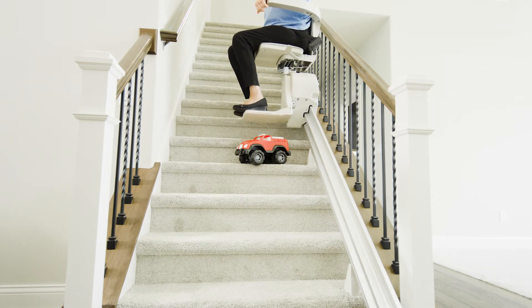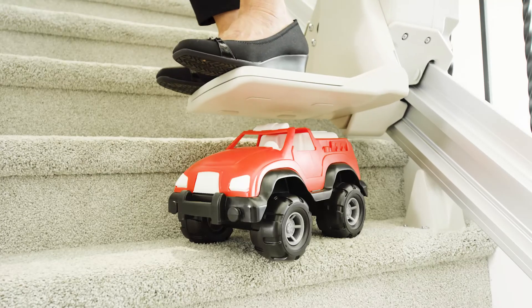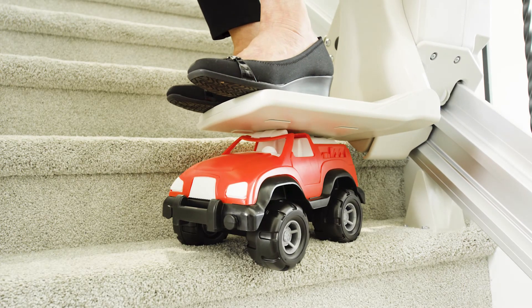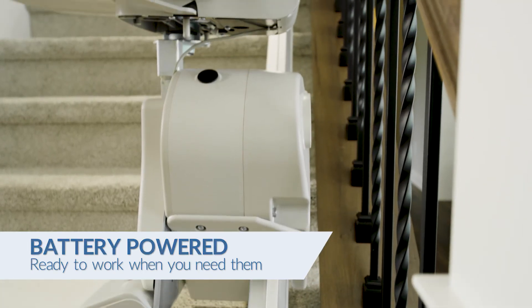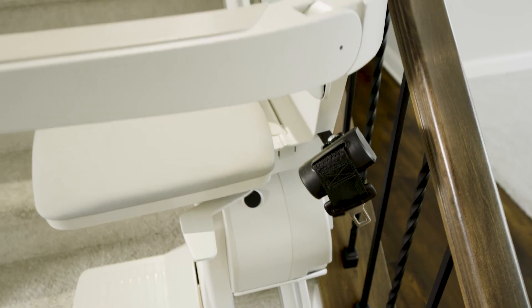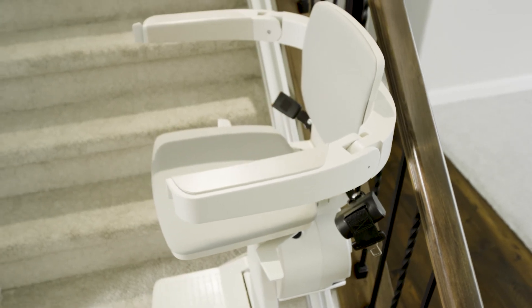Safety sensors on the Elan will gently stop the stairlift if you encounter any obstruction on the steps. Powered by batteries, the Elan stairlift continually charges anywhere it stops on the rail, ensuring dependable service even in the event of a power outage.